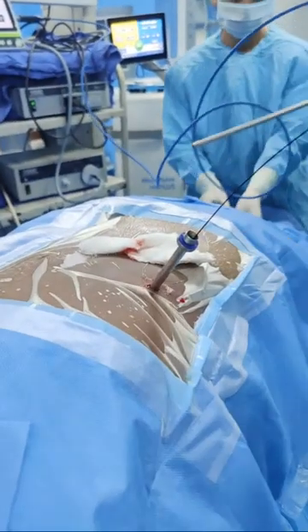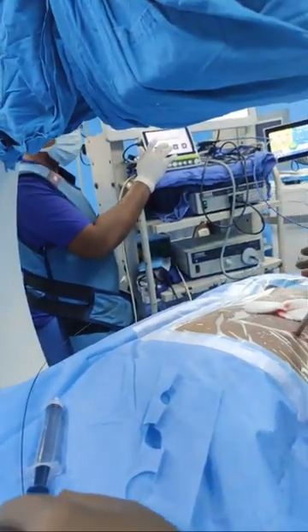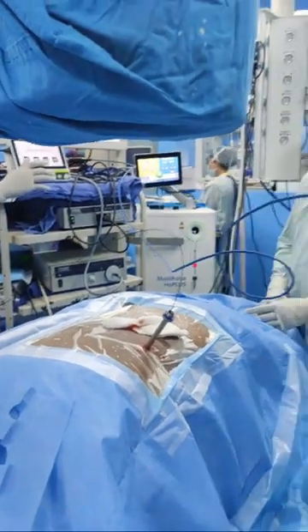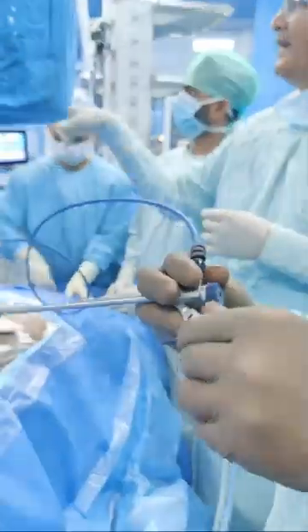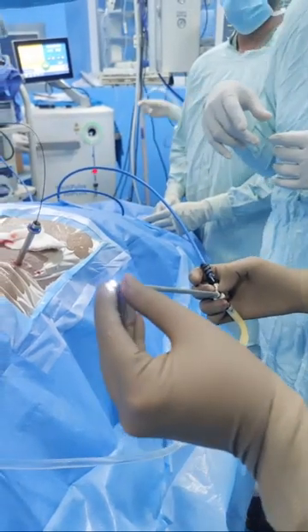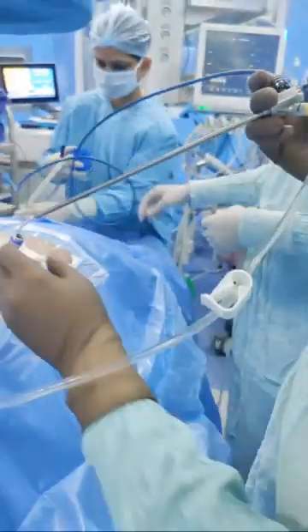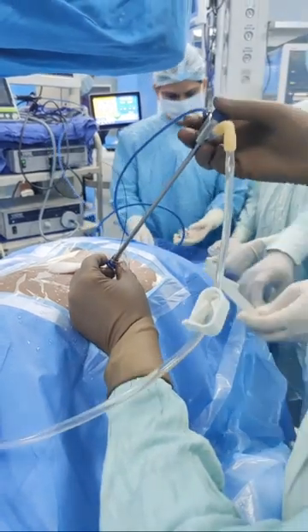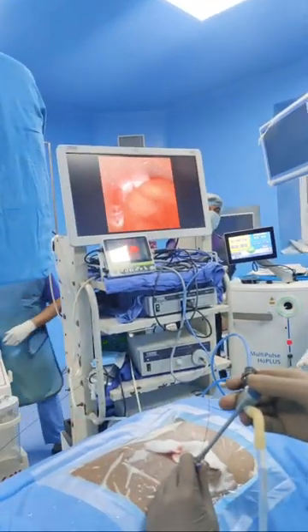So we have removed the obturator, and now we would be putting just the nephroscope and try to see if we are inside. Yes. So this is the nephroscope that we have chosen here. This is 16. This is the irrigation channel. We have put it here, and this is a chip on tip device. There is a chip for light, and there is an LED light source for visualization. So when you connect it, there is a very good irrigating fluid. So we have connected here, and now we will see whether we are in.